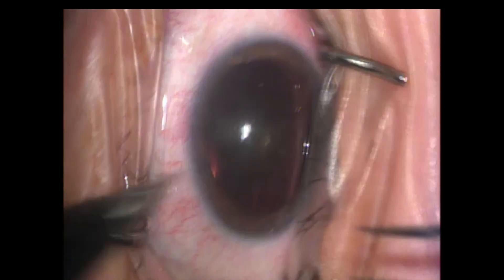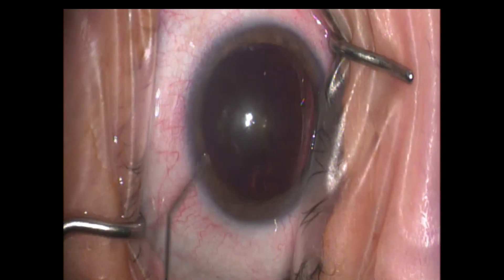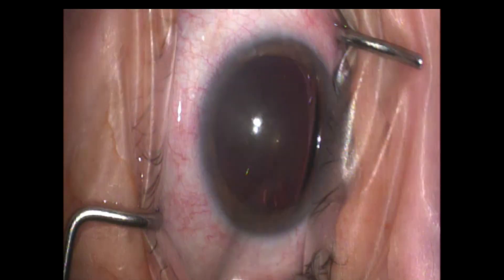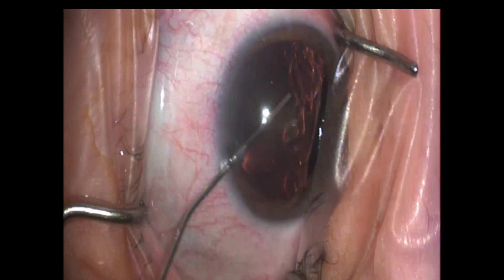This is a cataract surgery with implantation of the Bausch & Lomb MI60L lens. This is one of my favorite lenses for my high myopes. It's also a fantastic lens for anybody getting a mixed procedure, just because of the way the haptics are oriented and its stability in the capsule itself.